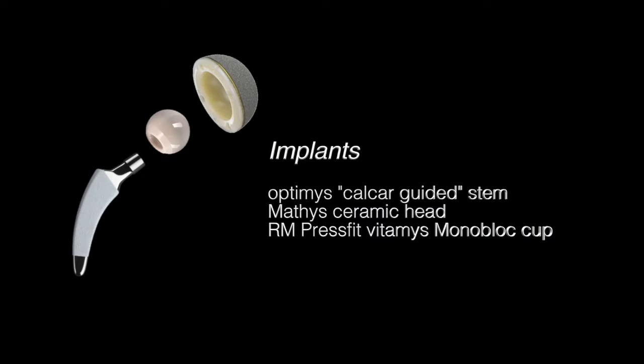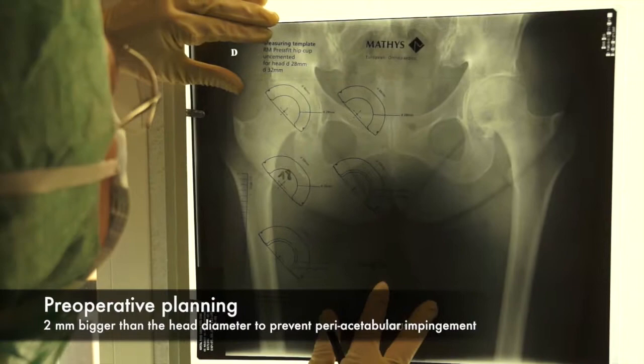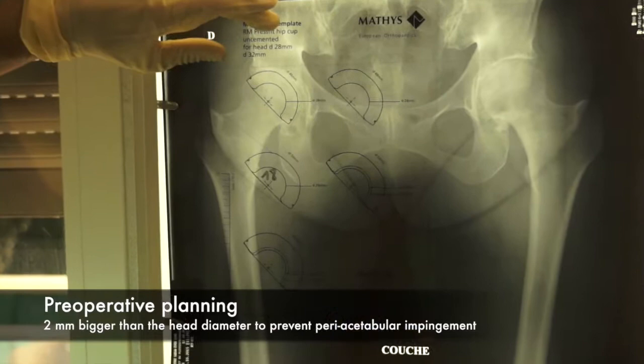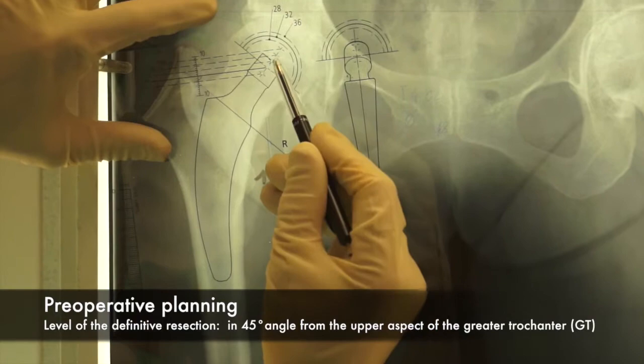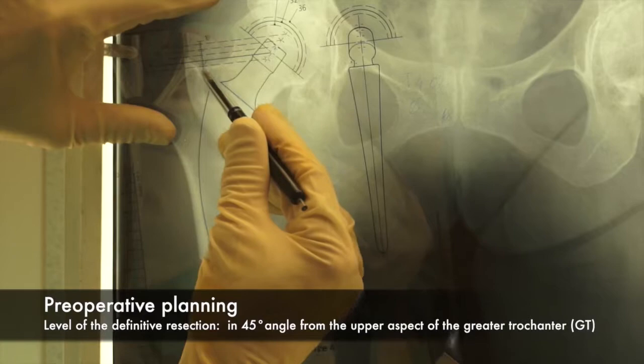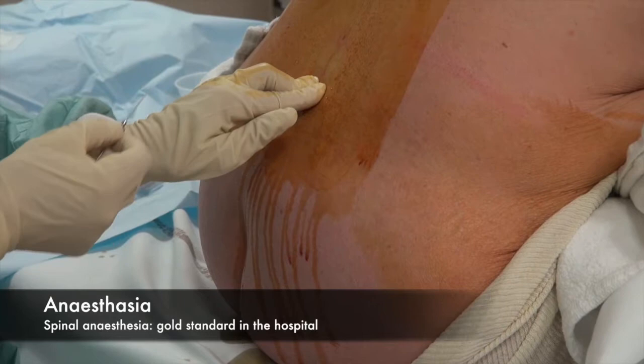Preoperative planning. 1. Choose a cup 2 millimeters bigger than the head diameter to prevent periacetabular impingement. 2. Level of the definitive resection at a 45 degree angle from the upper aspect of the greater trochanter. Spinal anesthesia, gold standard in the hospital.